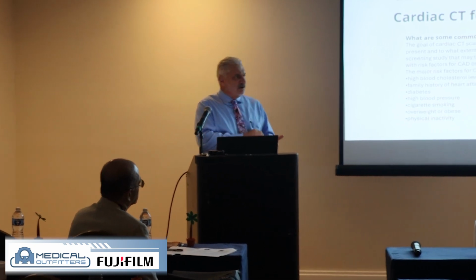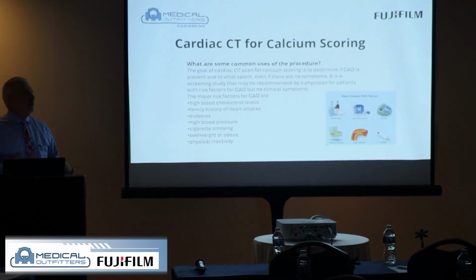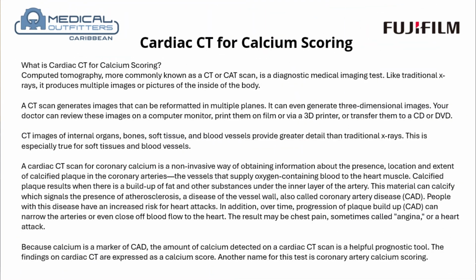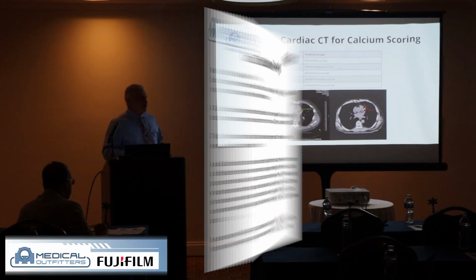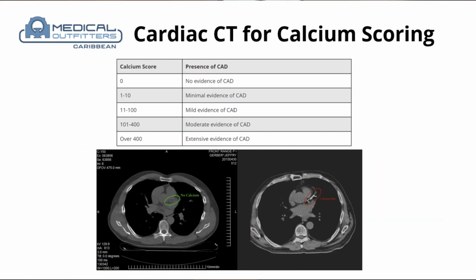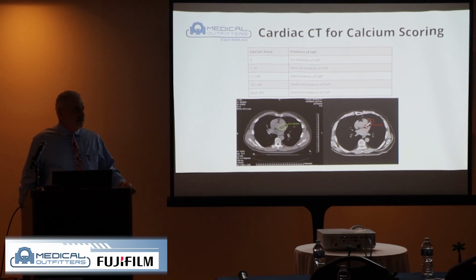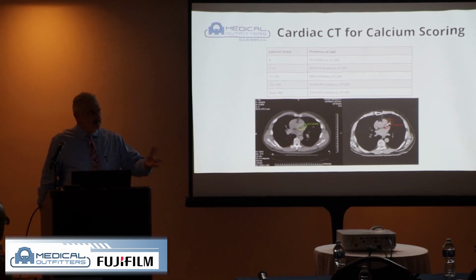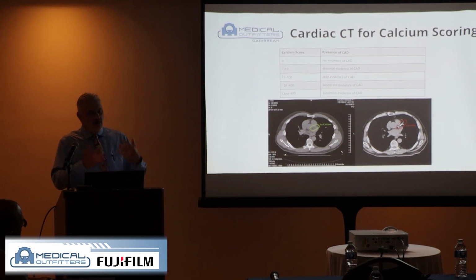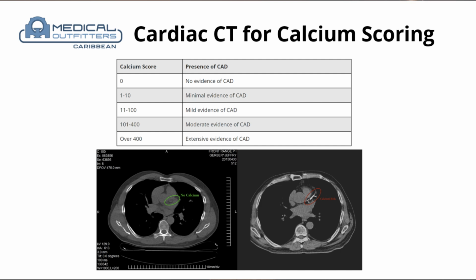I'm 6 foot tall, 260 pounds, and these are some of the risk factors that I have in my life. Then there's the presence of calcium in the heart, right? It's not used as a Bible for the diagnosis of the patient. You're going to be using the patient's history, how they feel, what their lab work is like. But if it's a patient off of the street, you're going to give them a report that tells them they have X amount of calcium score or volume within their coronary arteries.